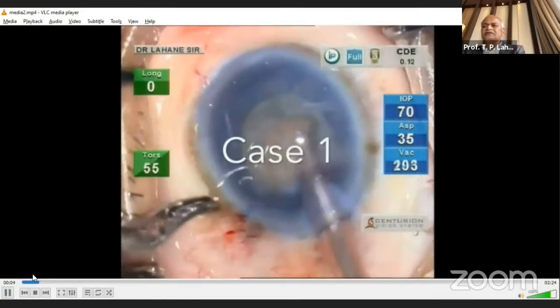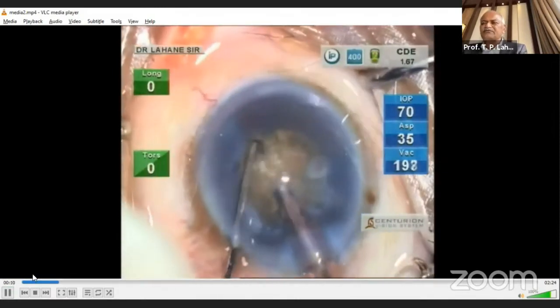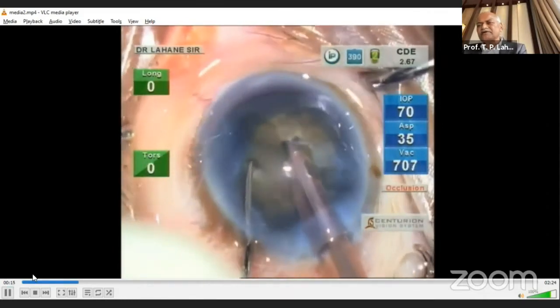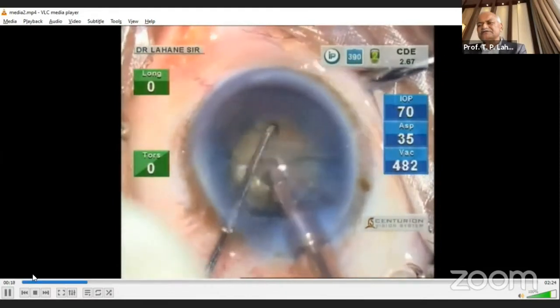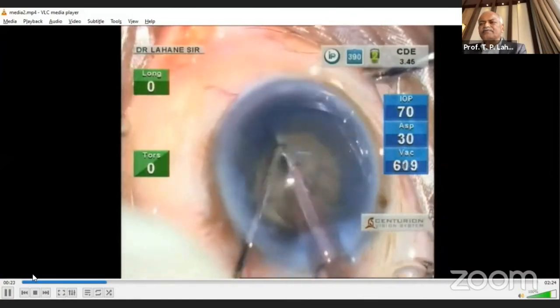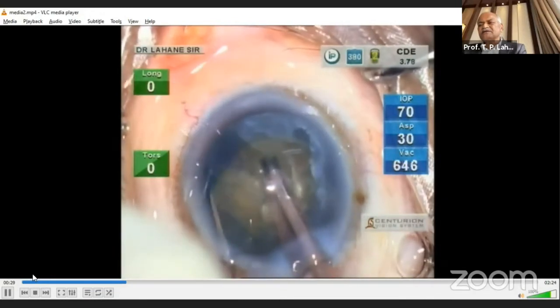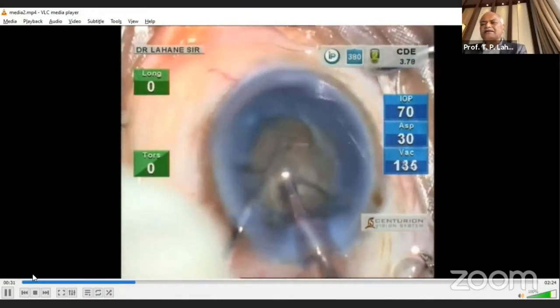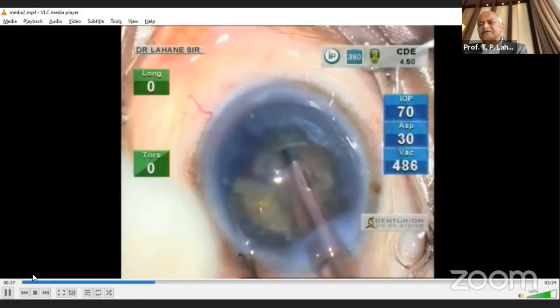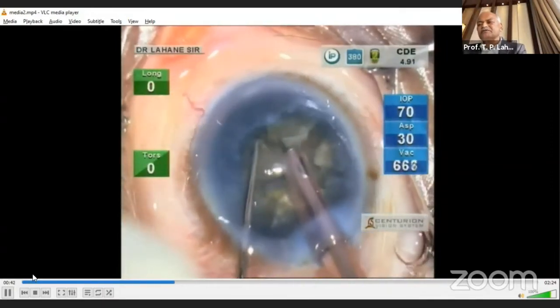Whenever we are doing a hard cataract, we must think in which case we can go for direct chop and in which case we should go for trench. When some whiteness is seen, you can go for the direct chop. When you see this chop I am doing, the separation should be up to the center of the nucleus. If it is not, then the pieces are attached with each other by fibers in the posterior part, those fibers will not permit you to take the pieces out and the phaco emulsification will be difficult.